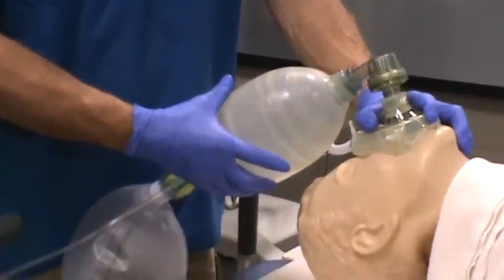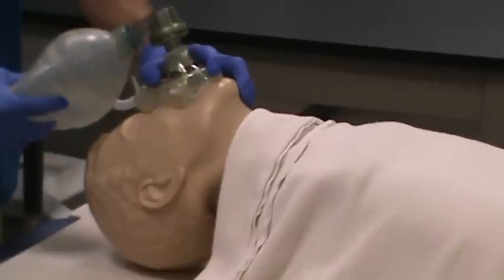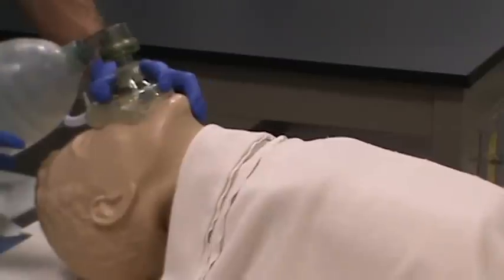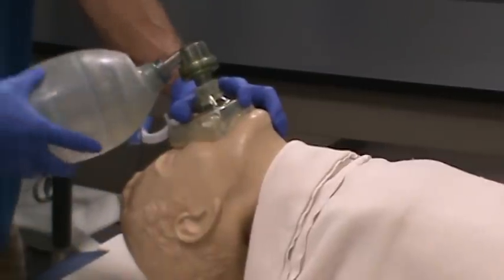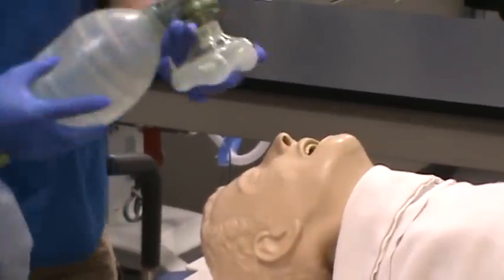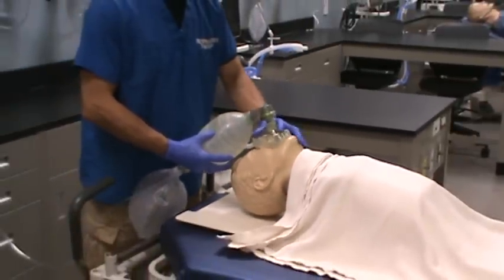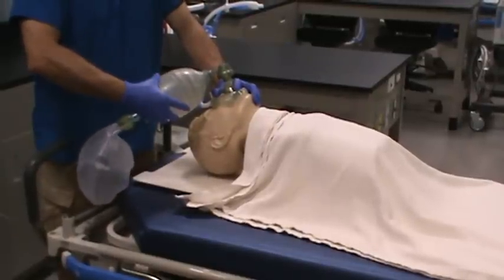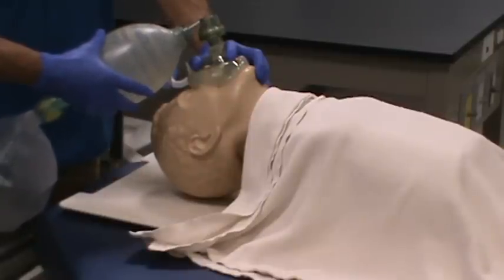When you ventilate the patient, look for chest rise. You should only need a small amount of pressure on the manual resuscitator to successfully ventilate and get gas into the lungs. If gas isn't going in, try repositioning the patient's head. Also make sure you have a good seal between the mask and the patient's face, with your fingers spread in the EC configuration. Focus on the rate and volume you want to deliver, ensuring good chest rise without excessive pressure.